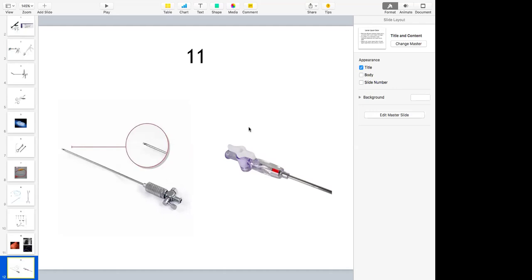Suppose you are doing TAPP and there is a peritoneal rent. What do you do? For deflation we can use a Veress needle. You keep putting a Veress needle inside the peritoneum and leave it as such for whatever gas is going into the peritoneum to escape through the Veress needle, so that the space you have created in the pre-peritoneal space is not compromised.